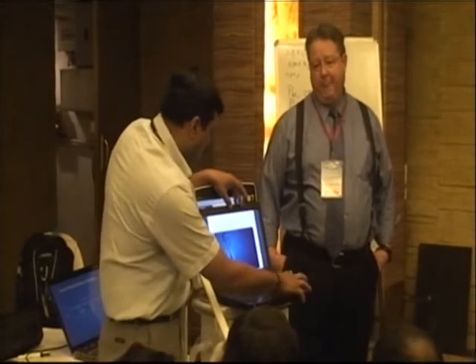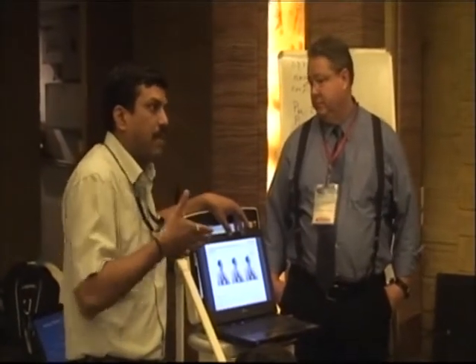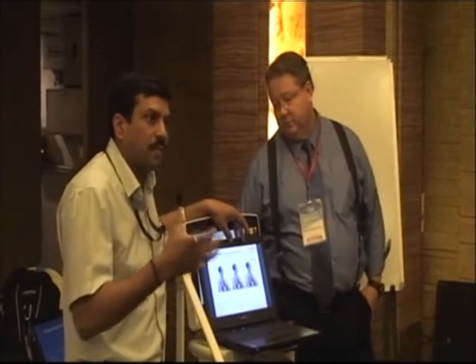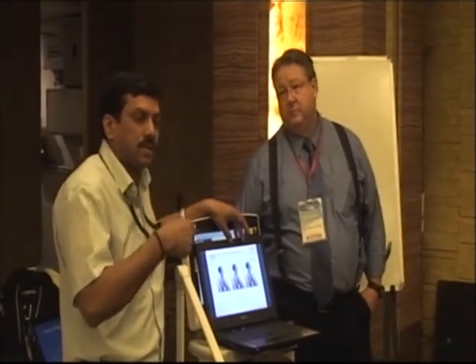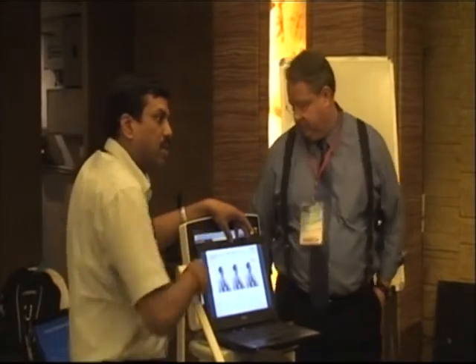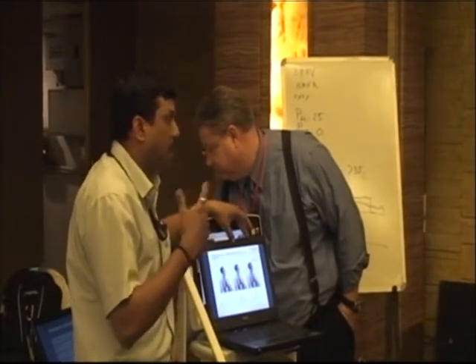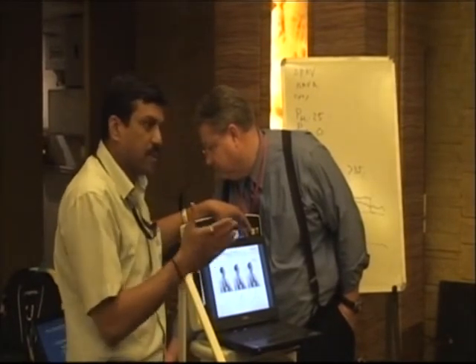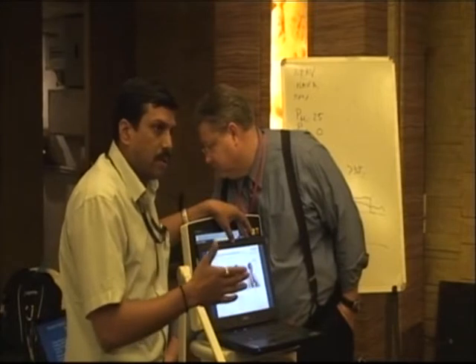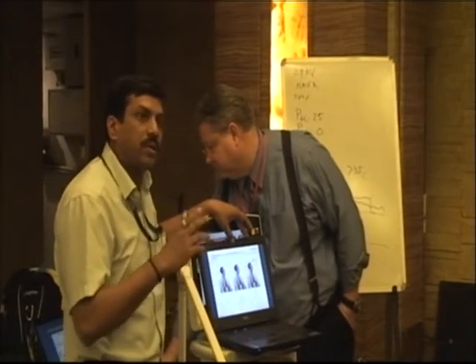So what this now does is, we take the electrical activity which is coming from the phrenic nerve to the diaphragm, where the excitement is happening. These activities are picked up by these catheters, and the signals are given to the machine, the ventilator. And the machine delivers the breath according to the patient's need. It is 100% synchronized with the patient's requirement. Okay? And the pressure support is also according to the patient's need.